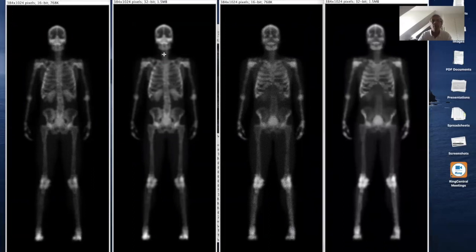We have the original, and we have the one with the Poisson distributed noise on. We have the original here for the attenuation and scatter, and the Poisson distributed noise. And perhaps you can see that this is a little bit more noisy because there are fewer counts. It's very important that you find the correct level, because the algorithm for adding Poisson noise looks at the pixel value.